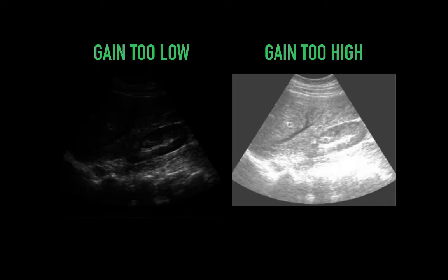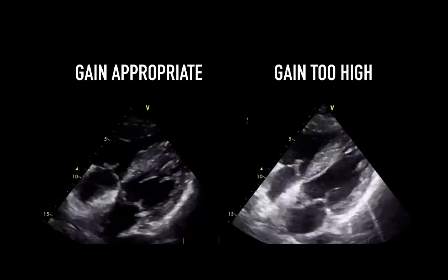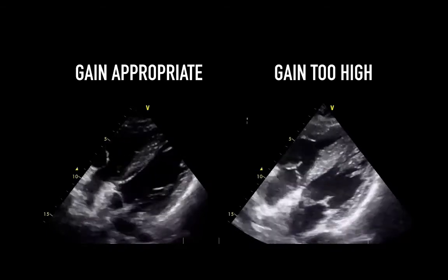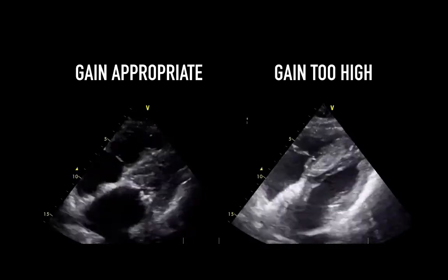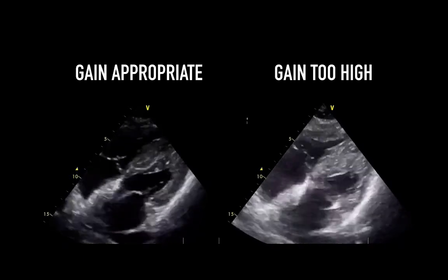Finally, gain. Again, there's no real way to set the ideal gain, but there is gain that's too low and gain that's too high. I'd use fluid-containing structures as your standard to set it. That way you can adequately hone your image. You can see on the left, appropriate gain where there's good endocardial resolution and good definition between hypoechoic, hyperechoic, and anechoic. And on the right where it's too white and leads to an increase in noise over signal.